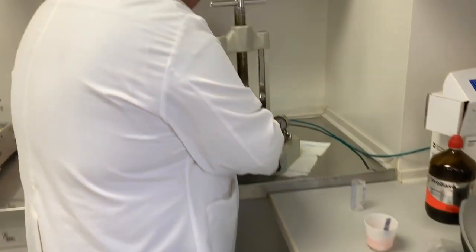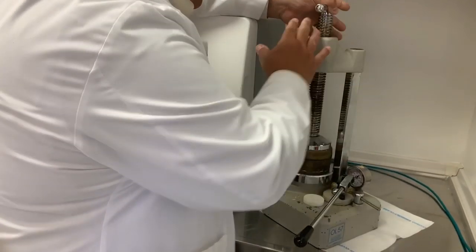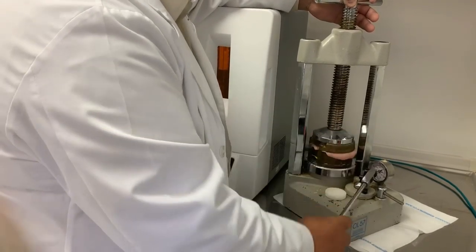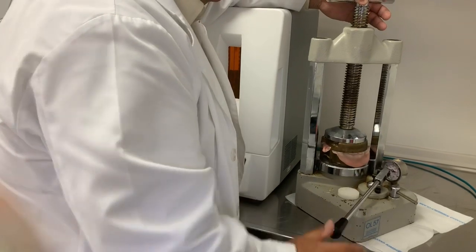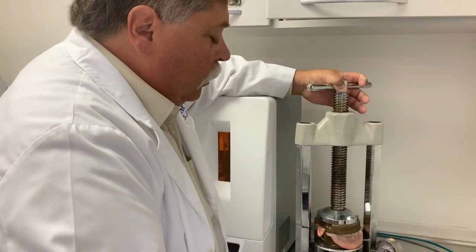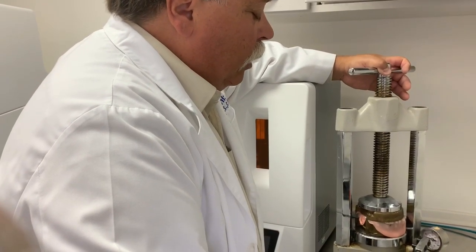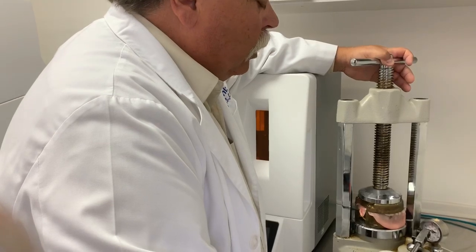I'm going to take this over to our hydraulic press and pump this up to 1,000 pounds of pressure. As you can see, all the excess acrylic is coming out. I will do this trial pack 2 or 3 times, depending on how it looks after the second or third trial pack. Then we will place this into another holding flask, and that will go into a water bath for a 2-hour time period.